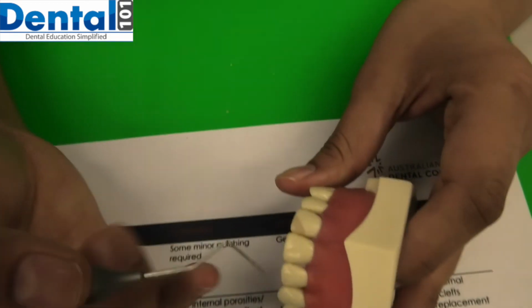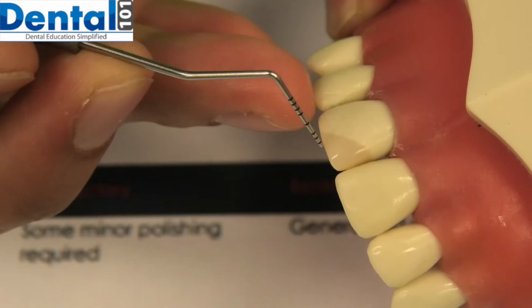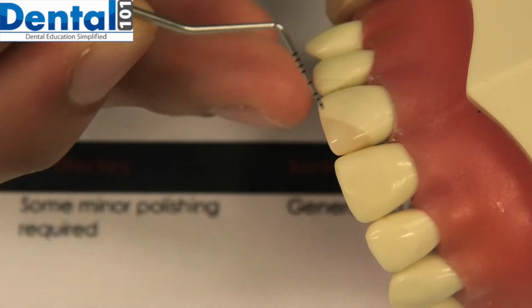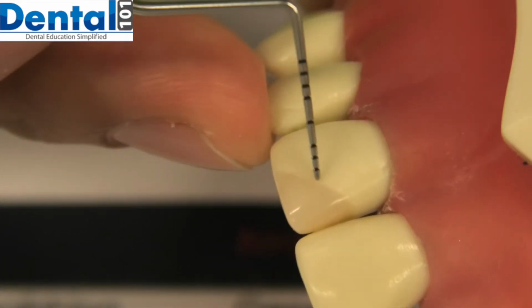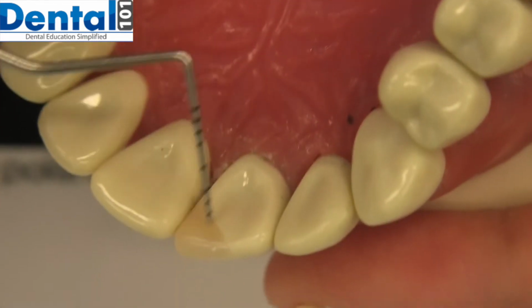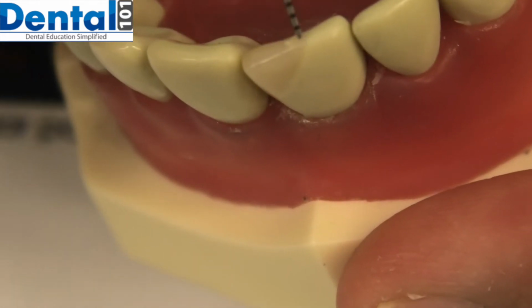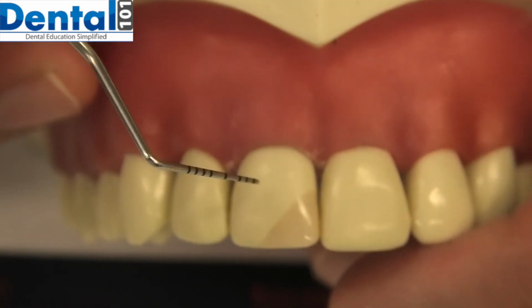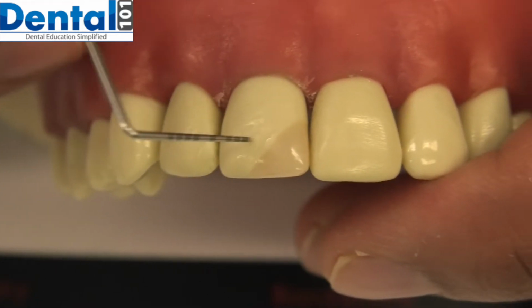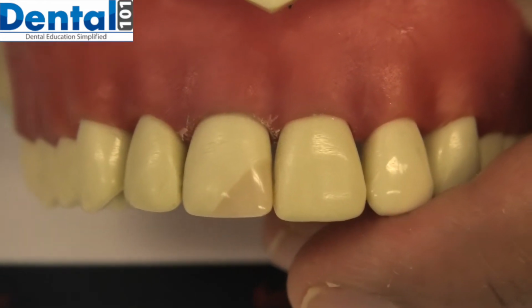So for my restoration, I will check the junction. Here I feel a catch on my restoration. That is because of the unfilled resin on the tooth structure. And on the palatal side, I don't feel any catch. There is no detectable junction. And on the incisal side, again, there is no detectable junction. Because it is just detectable with the probe, it will come under satisfactory, right?